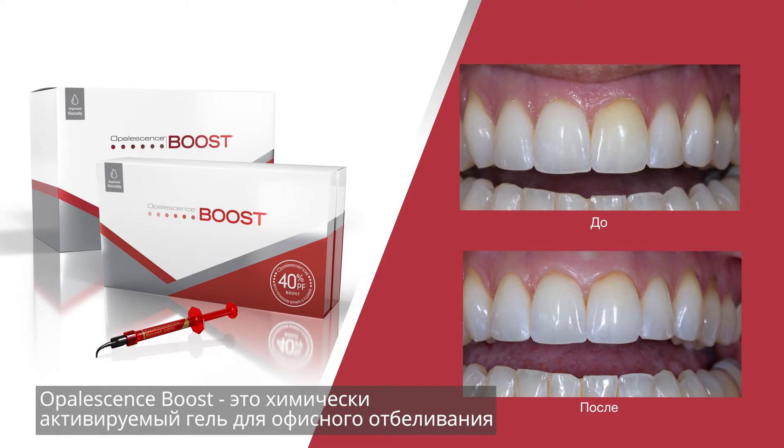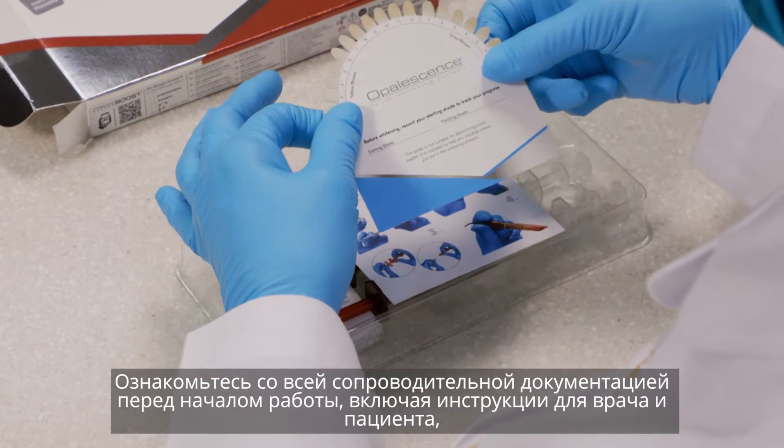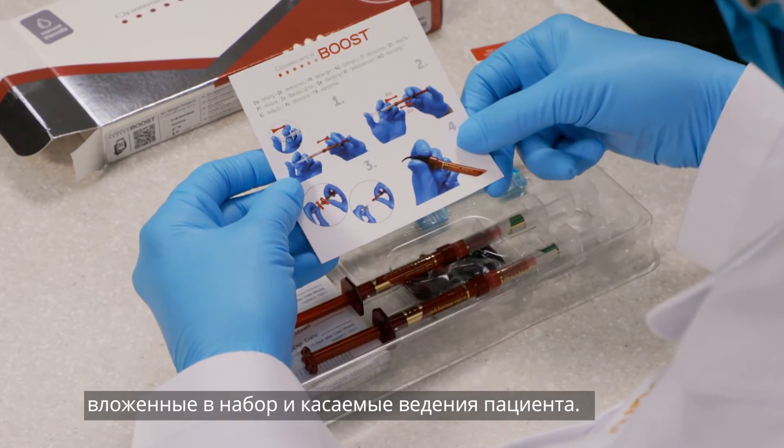Opalescence Boost is a chemically activated in-office tooth whitening treatment. Be certain to read the product instructions, warnings, and information for the patient contained in the package, and advise the patient accordingly.